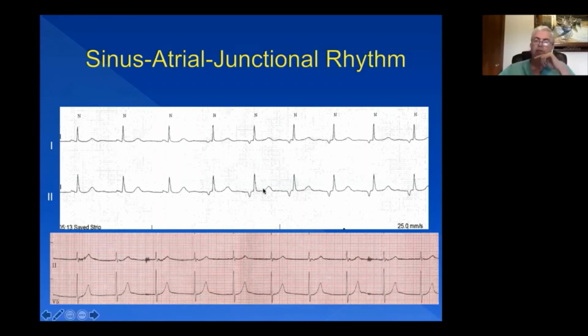And there's no specific therapy other than making sure there's no reversible cause for the sinus node to be slow that you can reverse. And if you have sinus node dysfunction that's been symptomatic because the heart rate slows down too much, that's when you may need to think of the possibility of needing a pacemaker.